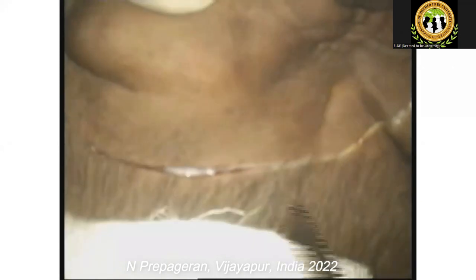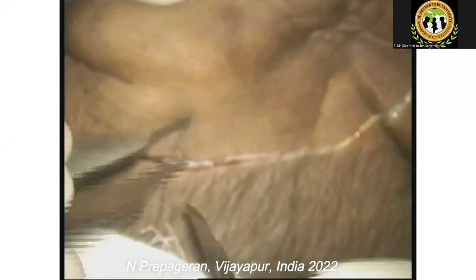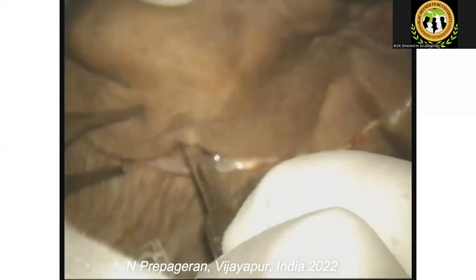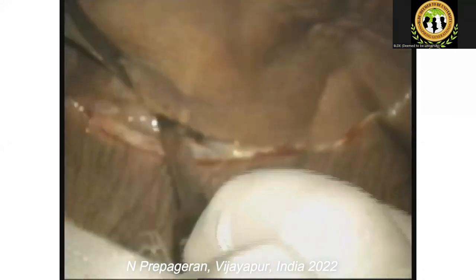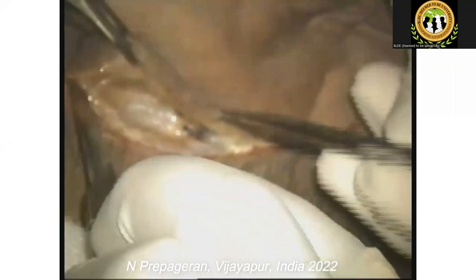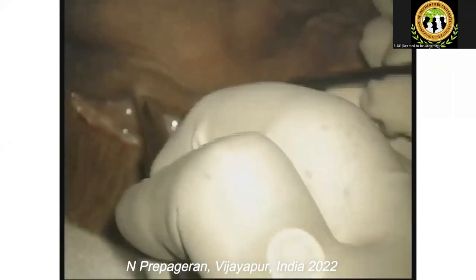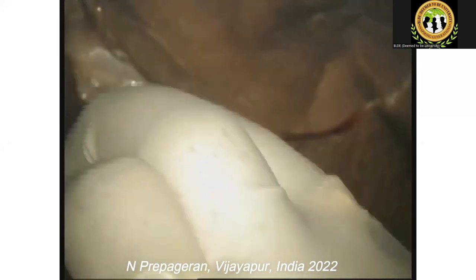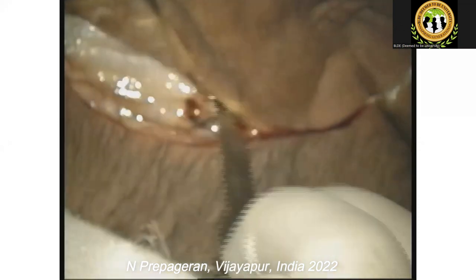And then what you want to do. You got a tooth forceps? Yeah, good. Thank you. What you want to do is go into the right plane. Once you're in the right plane, it opens like a book. So that's the plane. Can you see? You're just above the fascia.